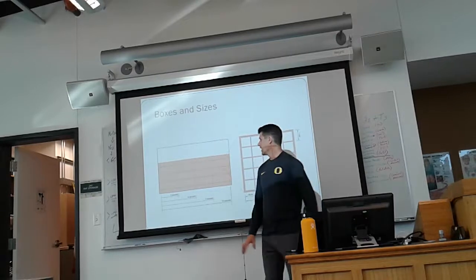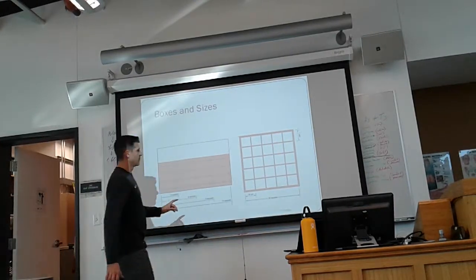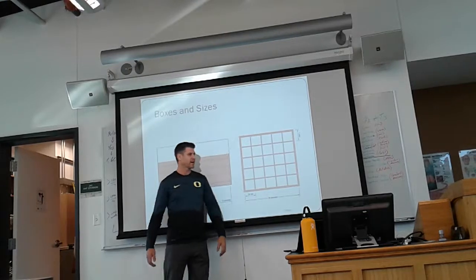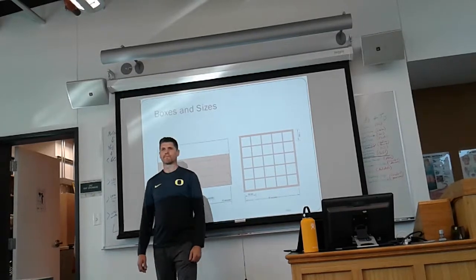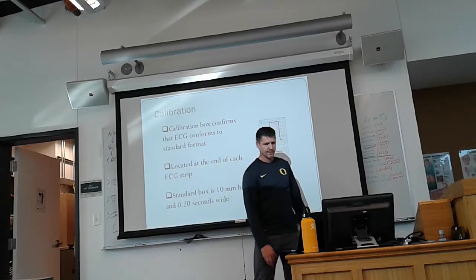Fantastic. Okay, there's an error on this picture, which I'll come back to in just a minute. So just look at this one over here. Every little box being 0.04 seconds, every large box being 0.2 seconds, every height being 1 millimeter. Make sense? Okay, disregard the 12-lead portion for just a moment, since there's an error.